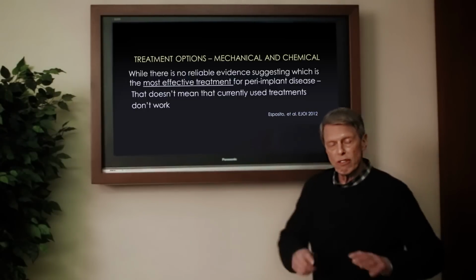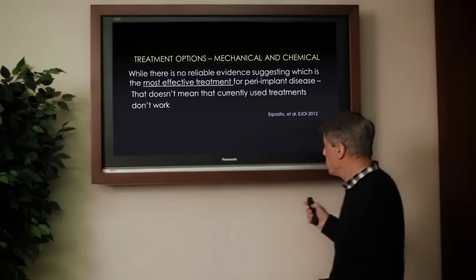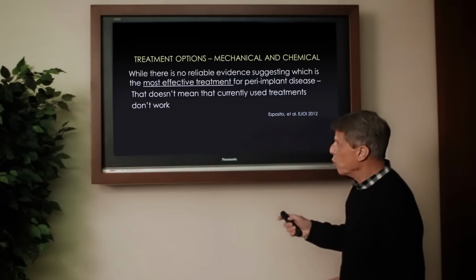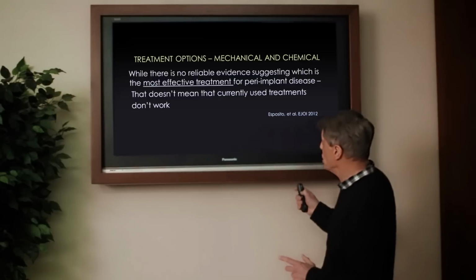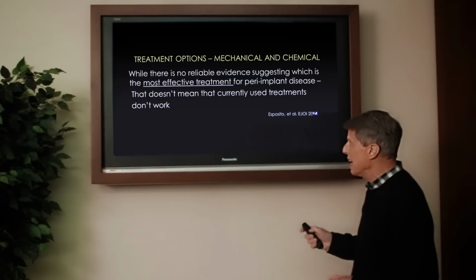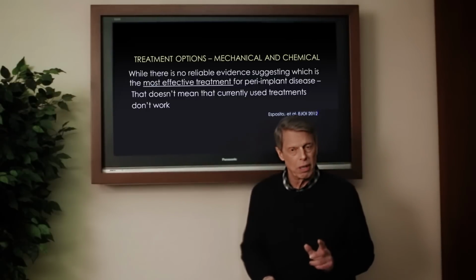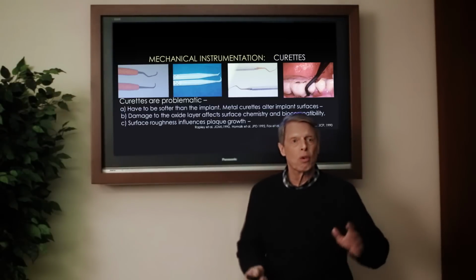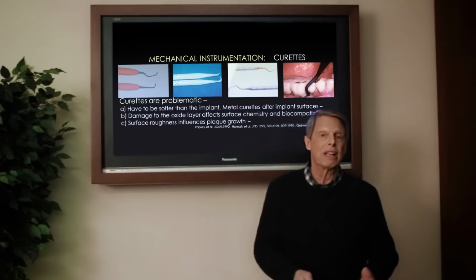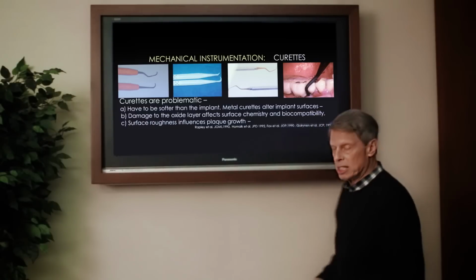And as far as those different ways to detoxify an implant surface, Esposito said it so well in 2012. What he said is, while there's no reliable evidence suggesting which is the most effective treatment for peri-implant disease, that doesn't mean that currently used treatments don't work. So let's take a look at what I'm going to suggest that you use to detoxify the implant surface. First, we're going to be using curettes.